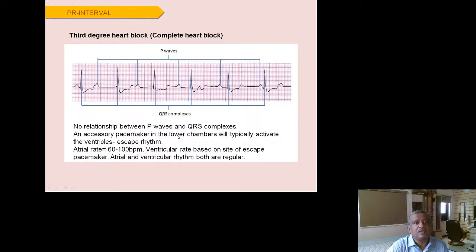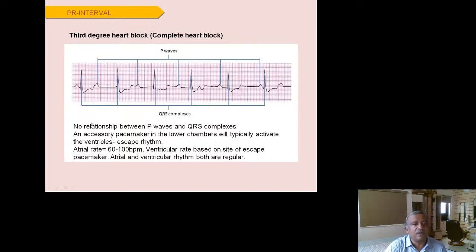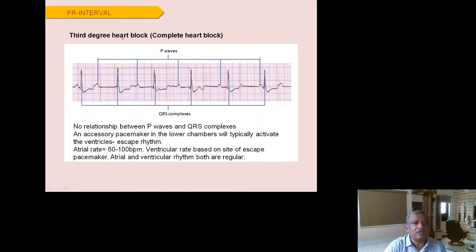Third-degree or complete heart block is AV dissociation — P waves and QRS complexes occur independently with no relationship. P waves come from the atria at a regular rate, and QRS complexes come from the junction or ventricles at their own regular rate, but the P wave does not conduct through the AV node to the ventricles. Both atrial and ventricular rhythms are regular on their own, but there is no correlation between them whatsoever.